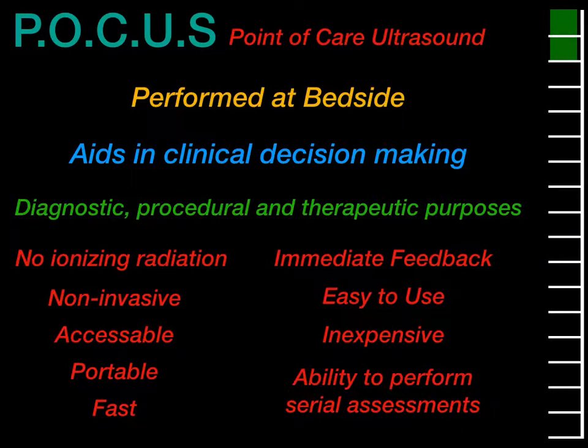Now before we get started, I wanted to discuss a few brief words on point-of-care ultrasound and why it's become so popular in almost every field of medicine. Importantly, ultrasound can be performed at your patient's bedside in order to aid you in your clinical decision-making process. Ultrasound can be diagnostic, procedural, or therapeutic in its use. There's no ionizing radiation involved. It's non-invasive, relatively accessible, portable, and efficient with your time.